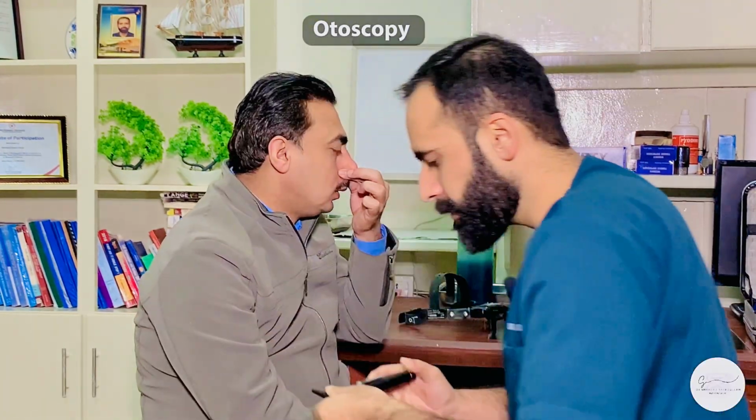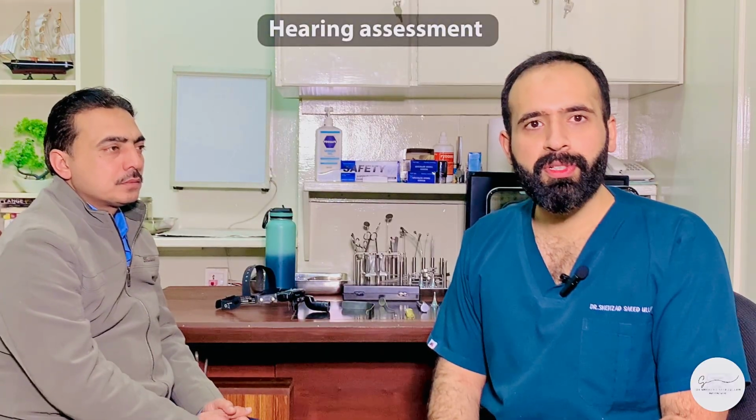That's it. So in this way we can also see the function of eustachian tube, and we can also look for the mobility of the tympanic membrane. After examination of the tympanic membrane, the next step is hearing assessment. So in order to do hearing assessment, we will do the whisper test, and we are going to do the tuning fork test, which are Rinnies and Webers.